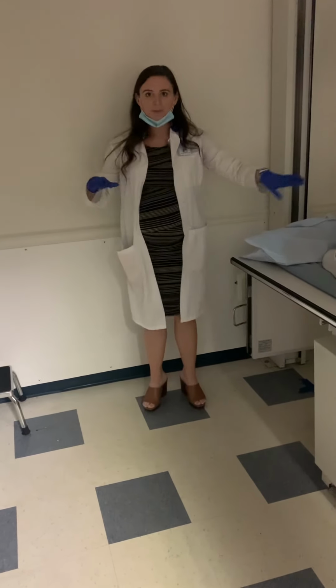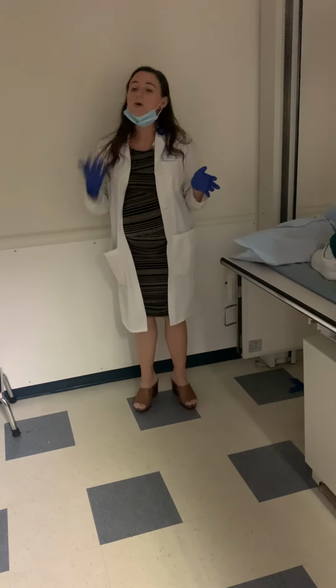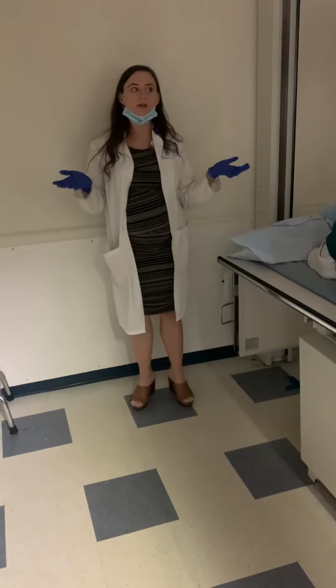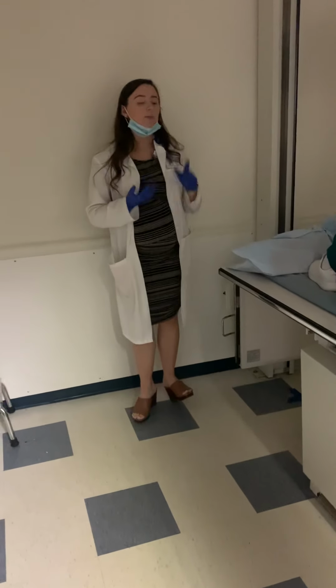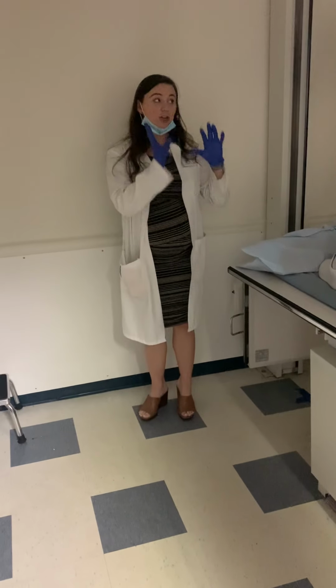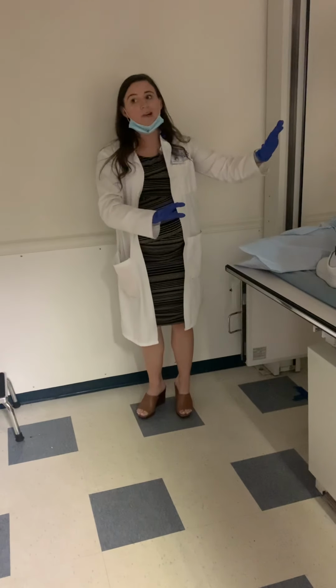Now we're here. These are called after films, post films, overhead films, all exchangeable. You might hear them in clinic. After films, overhead, post films. So the fluoro is done, and now we are just going to take a straight x-ray of her.